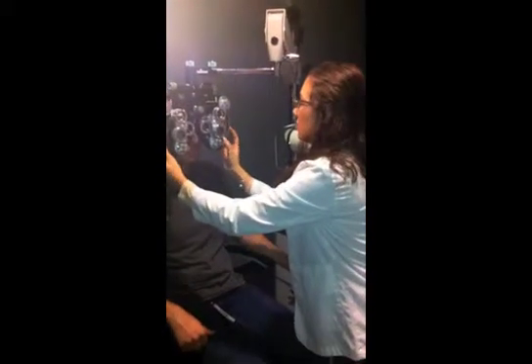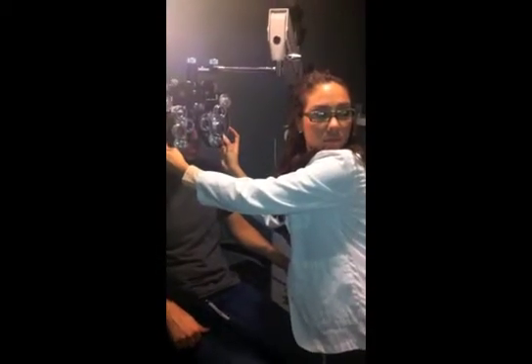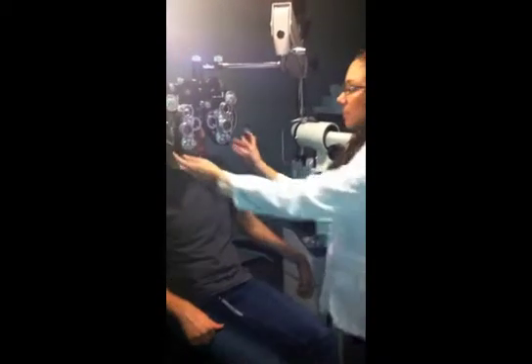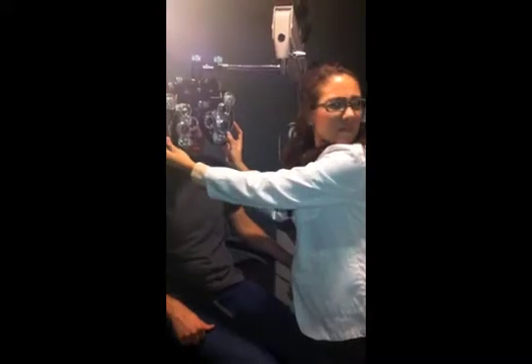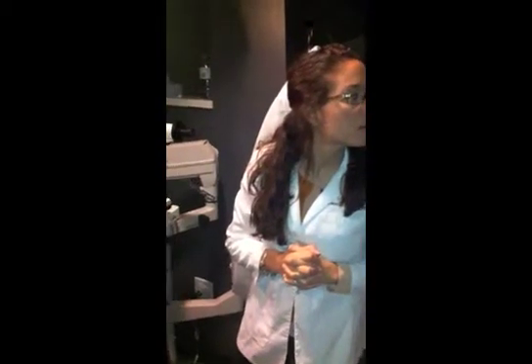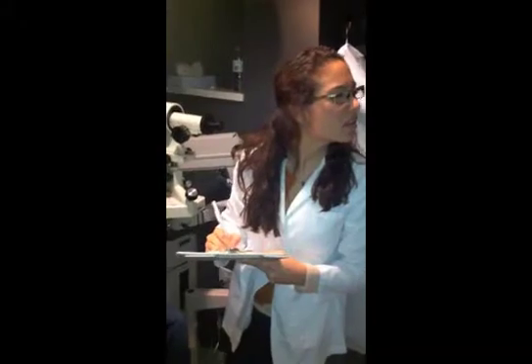Are you ready? Can you see that line? Nope. Let me know when you first start seeing it. A-T-K-Z-T-C. Excellent. Can you read that line? U-A-N-C-O-H. Is this clear for you? Read it for me: U-A-N-C-A-D-H. Excellent. You got the same V/A, so we're going to keep them there. Read it for me: U-A-N-C-A-R-H.